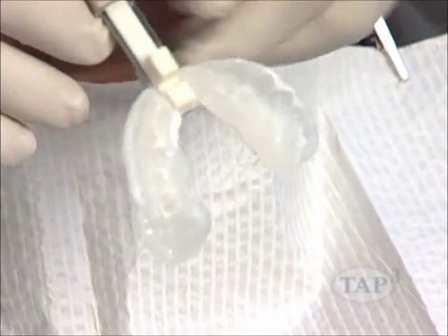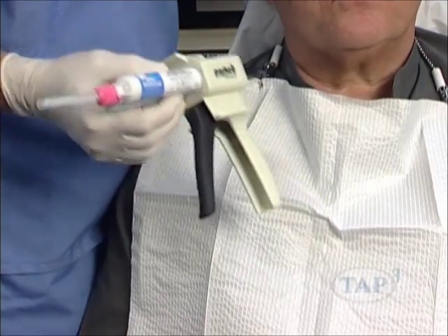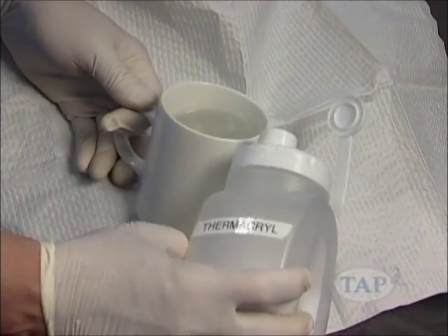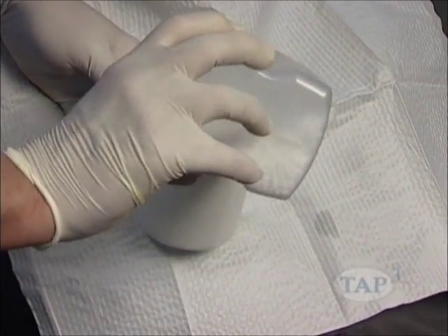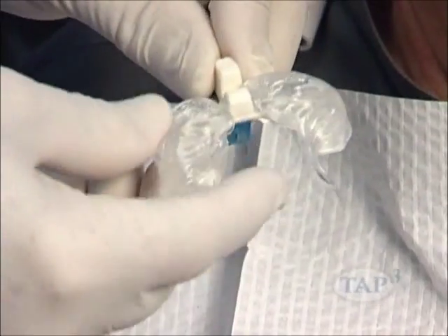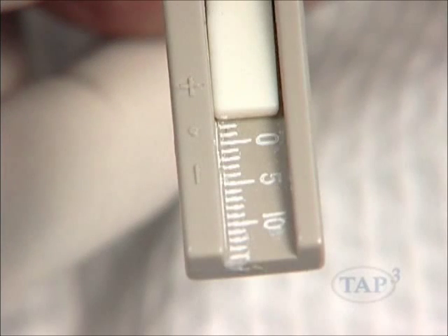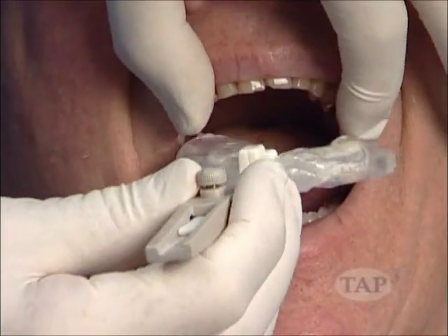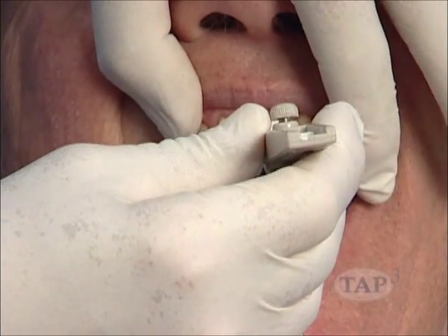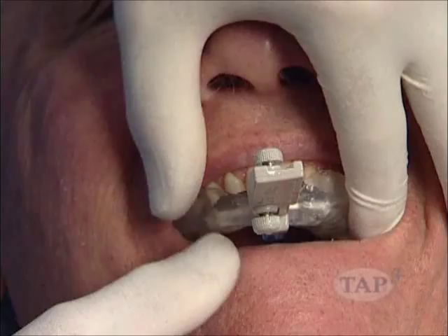You can take a bite registration with 2 materials, thermocryl or blue mousse paste. Heat a small amount of thermocryl pellets in a heat-resistant cup until it becomes clear and soft. Place the thermocryl on the bite fork. Set the George gauge. In this case, it is 50% of the patient's maximum protrusion. Place it in the patient's mouth. Orient the bite fork along the midline with the handle parallel to the occlusal plane and directly forward.